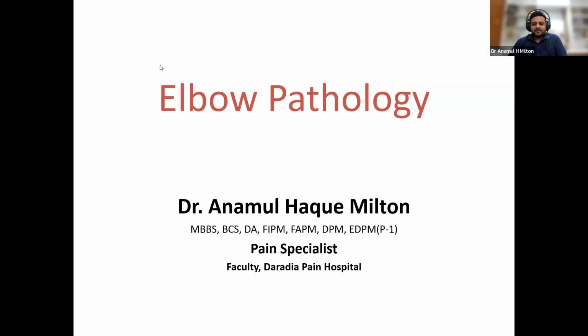After a nice anatomy and ultrasonogram demonstration, now we are looking forward to the elbow pathology.